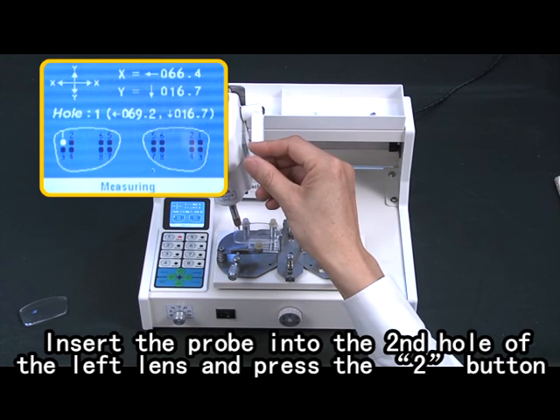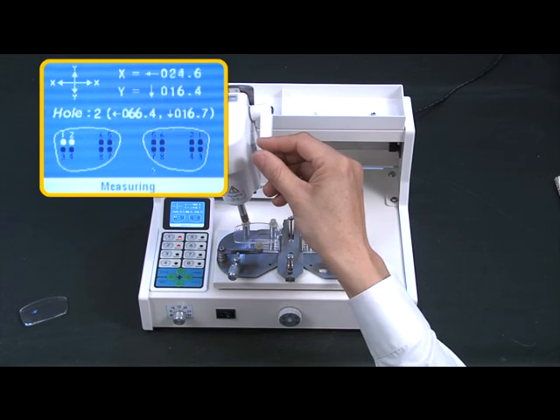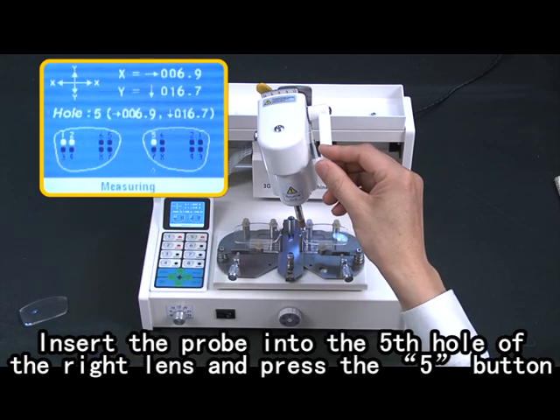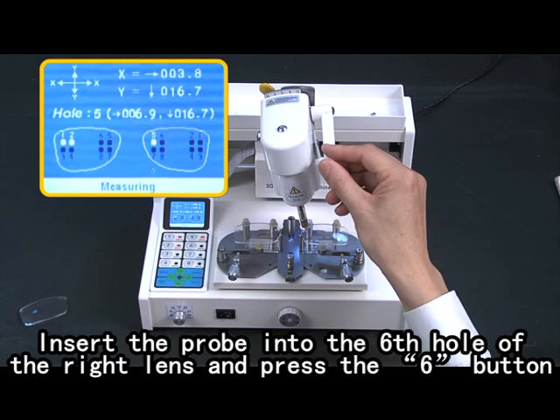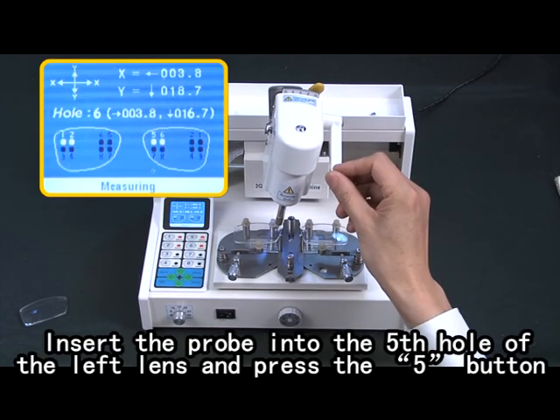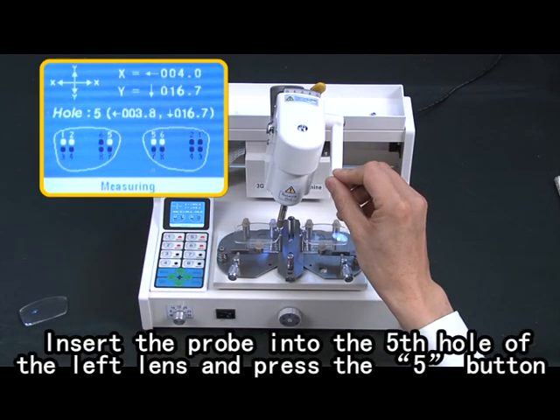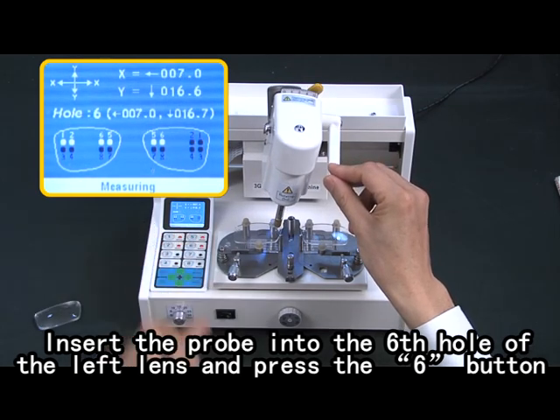Insert the probe into the second hole of the left lens and press the two button. Insert the probe into the fifth hole of the right lens and press the five button. Insert the probe into the sixth hole of the right lens and press the six button. Tilt the head to the right. Insert the probe into the fifth hole of the left lens and press the five button. Insert the probe into the sixth hole of the left lens and press the six button.